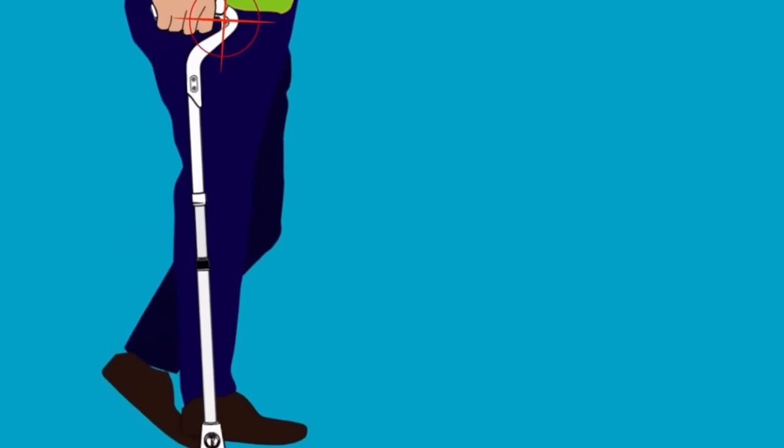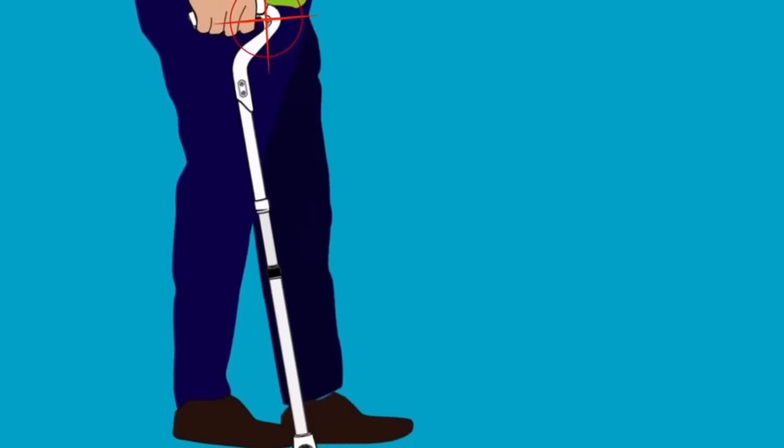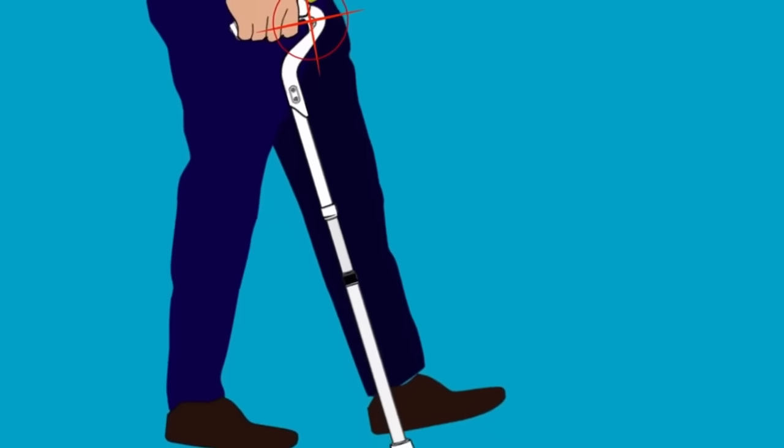As you can see, the hand stays in the same position. Once again, the Ergocane does all the work to keep the patient moving forward.